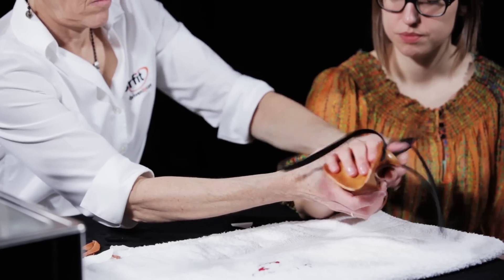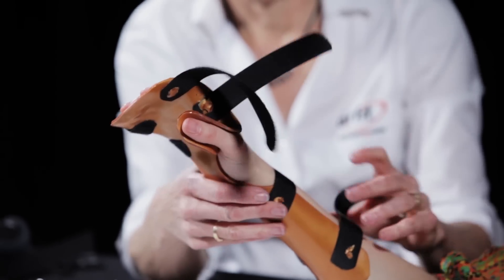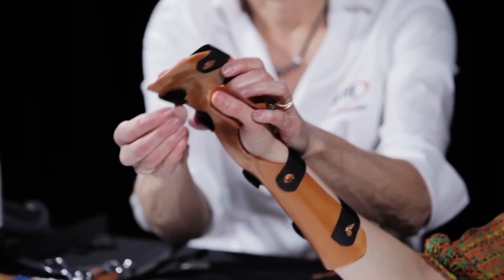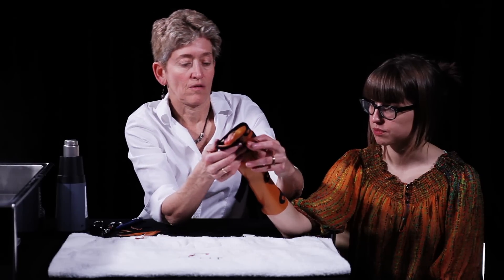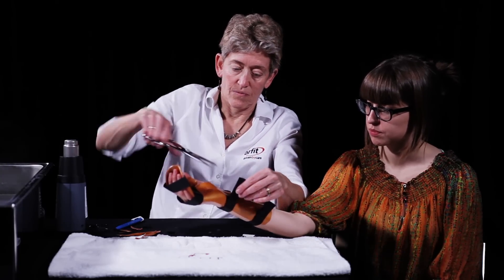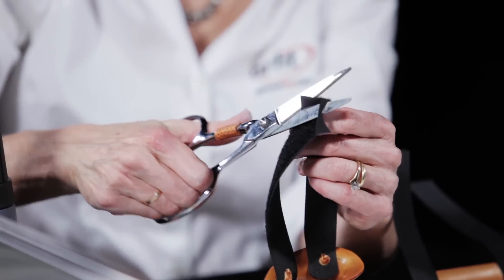Place the orthosis back on the patient to check the fit and trim the straps. The orthosis should secure the wrist in slight extension and the thumb in wide abduction while allowing the fingers to rest in slight flexion.